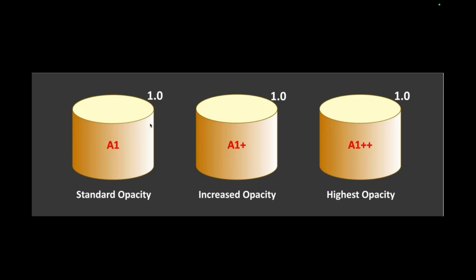So when you work through ingots, and this is an old ingot shot, but I think you kind of get the idea that at 1 millimeter thick, if that's what your restoration is, I have a certain amount of opacity. If I use a more opacified ingot, like an MO, like I would have here, well, I'm going to have a much more opacified ingot.